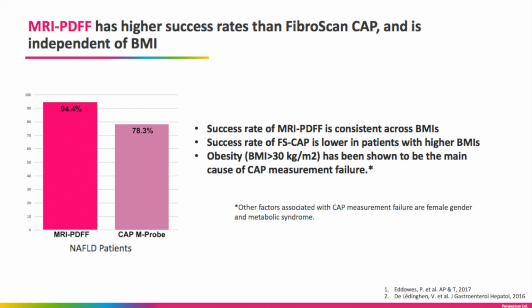An important advantage of MRI using PDFF to measure liver fat is that the success rate of this technology is consistent across BMIs, and success rates average 95%, as shown in the first bar of this graph.